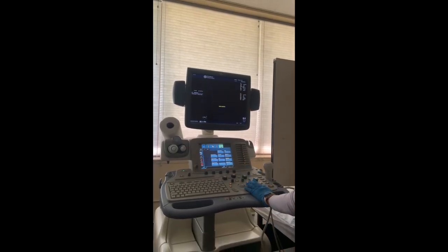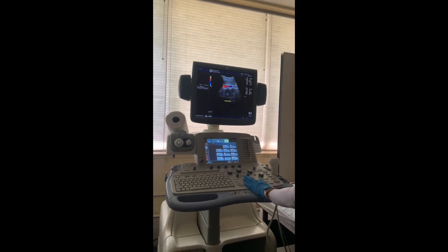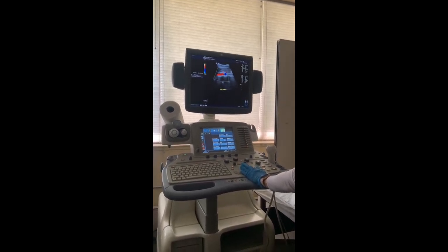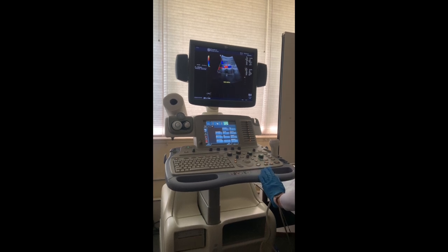Because the aorta is a vessel, we should evaluate its direction of flow by using color Doppler. You can also check for its velocity and waveforms by using the pulse wave function.